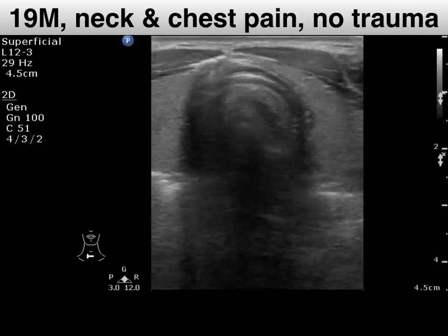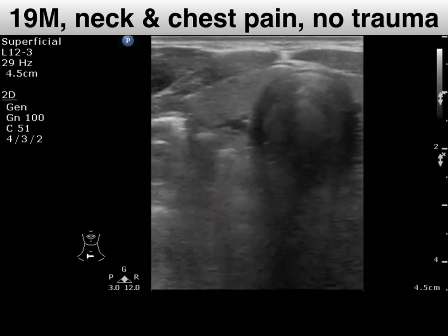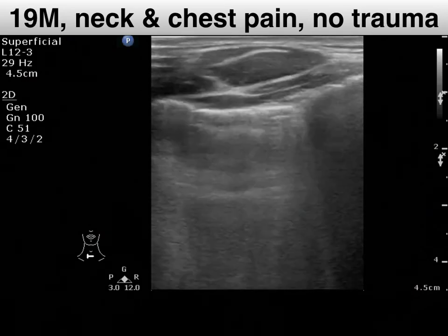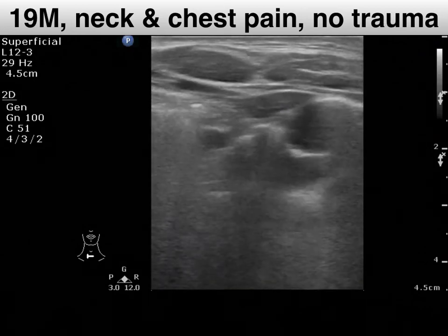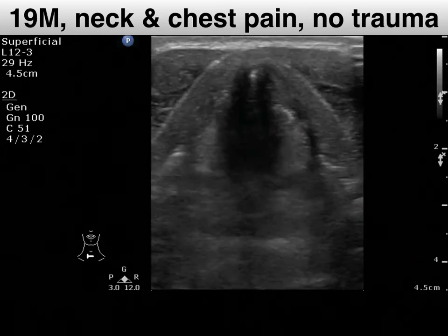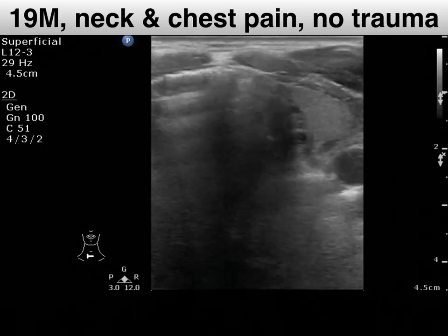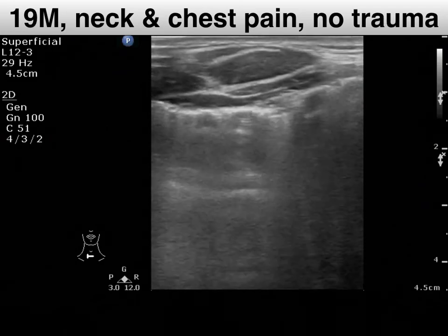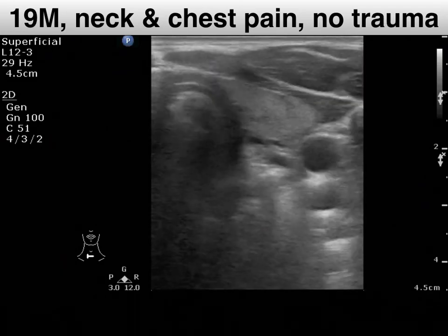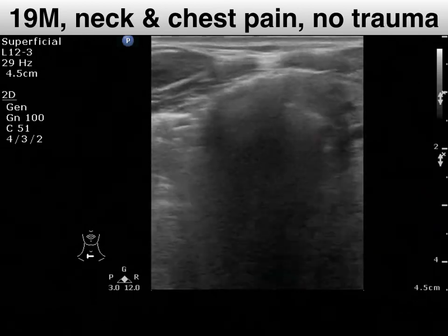Really lymph nodes? If that is lymph node, then I will be a bad presenter. Why? Because I have to keep the lymph node clear to demonstrate the structure. What do you see? Where is the abnormal finding? Can you see all the anatomy clearly? Why?